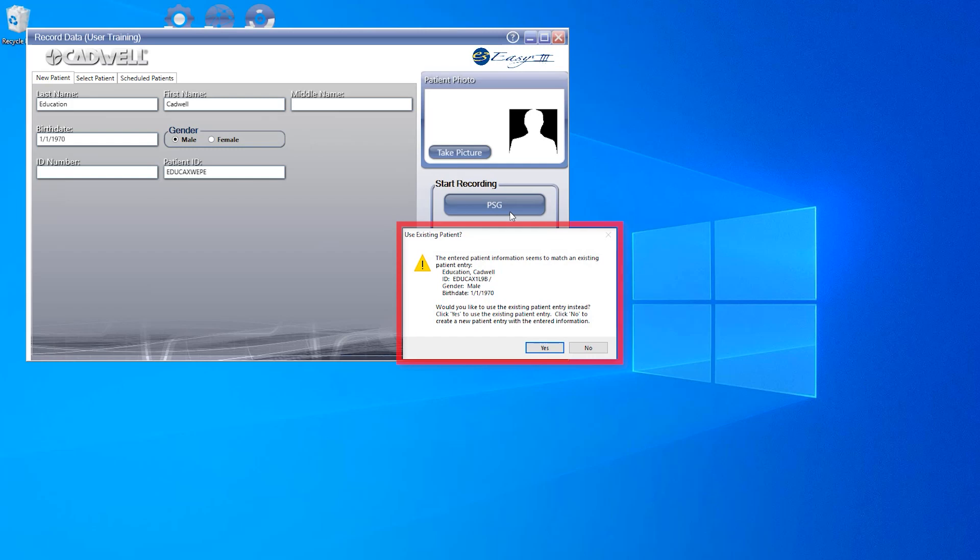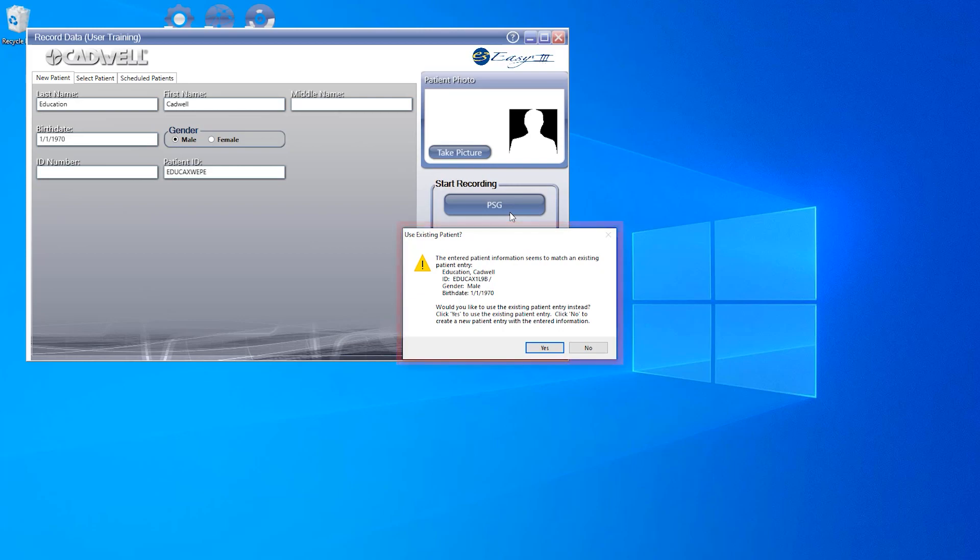If you have input patient information that matches information of a previously recorded patient, you will see a message pop up. The use existing patient question pop up is to help reduce patient duplication within the EZ3 system and manage your patient studies more effectively. If you verify that the patient information is in fact the same, you can click Yes.